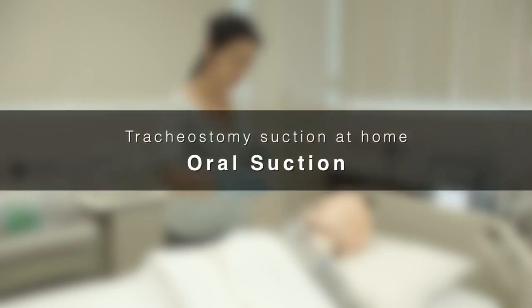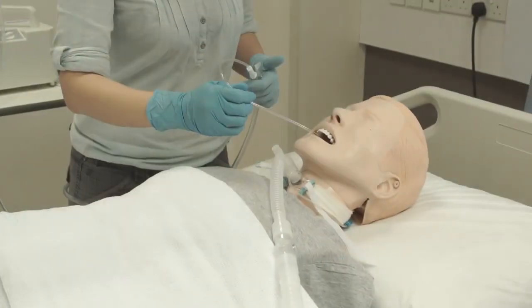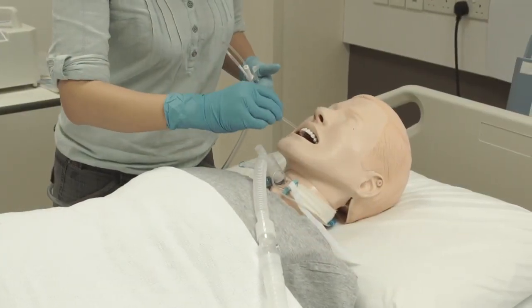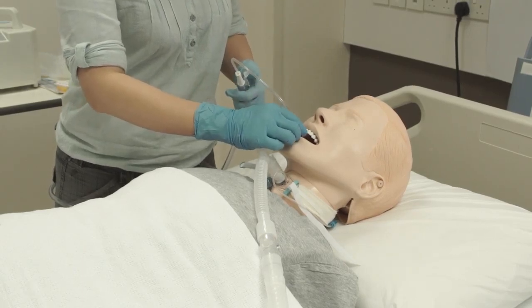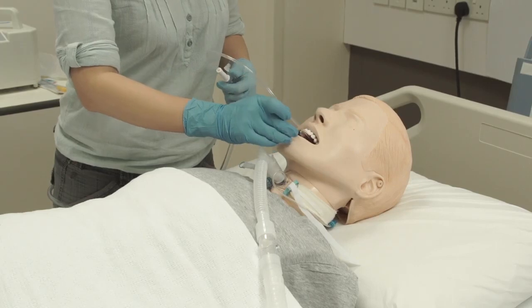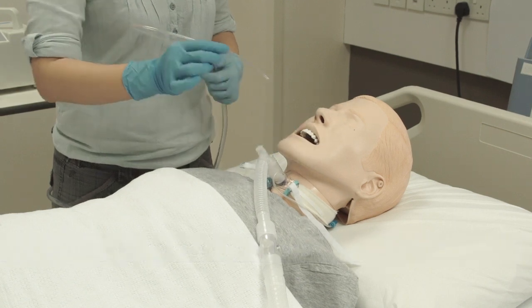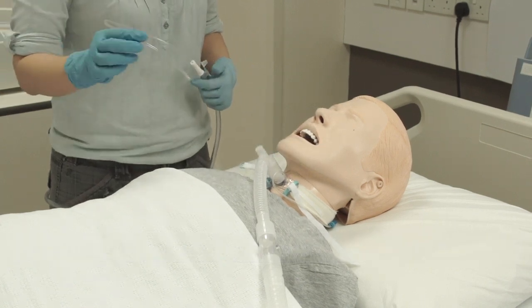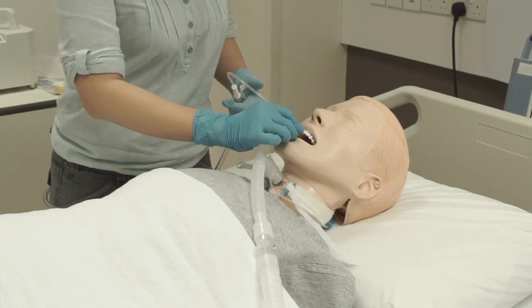Perform oral suction if there is any secretion in the patient's mouth. Oral suction is a non-sterile procedure. Gently insert the suction catheter following the curve of the tongue. At about 10 to 15 cm, the catheter will reach the back of the throat. If the patient coughs and gags, stop suctioning. Apply suction and remove the catheter slowly. Repeat until secretion is cleared.